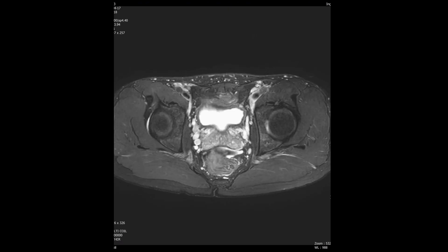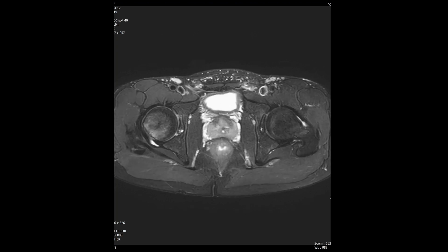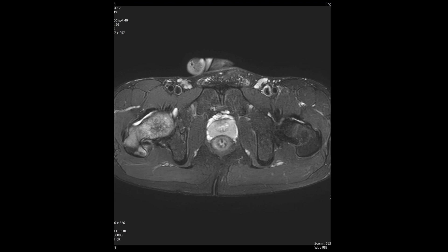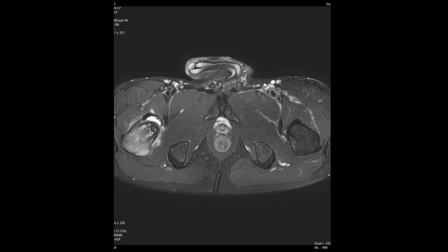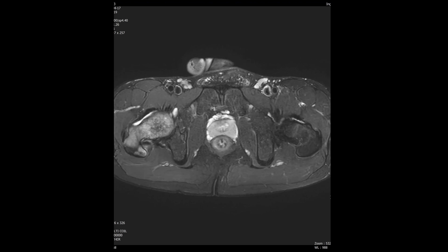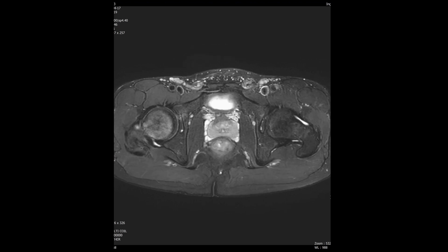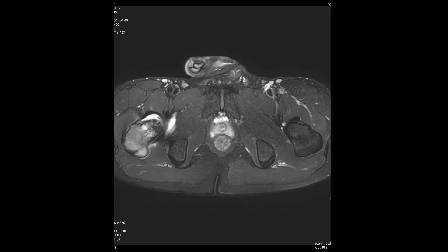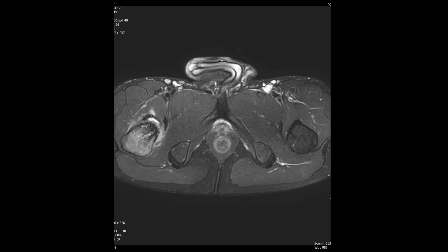Let's move on to the MRI findings. I will first demonstrate the axial and coronal T2 fat-saturated images. Axial T2-weighted MRI confirms a diffuse marrow-replacing lesion, represented by a high-signal-intensity soft tissue mass extending from the uppermost portion of the femoral neck through most of the femoral neck into the trochanteric region and proximal femoral shaft. There is also joint effusion and transperiosteal infiltration of soft tissue extending through the periosteum into the adjacent soft tissues at the antero-inferior aspect of the femoral neck and proximal trochanteric area.